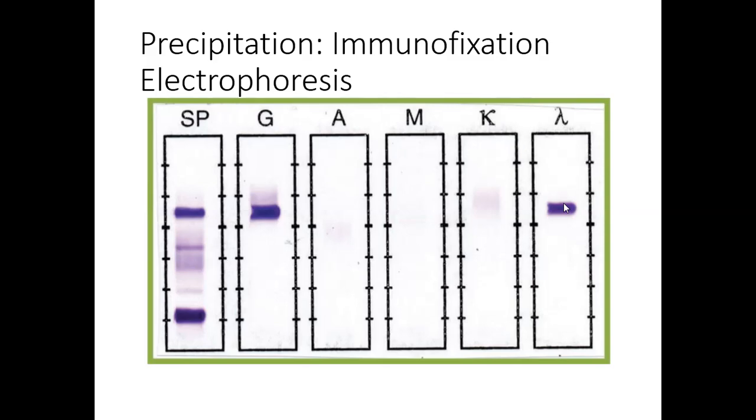Why do we do this? We're really looking to determine sort of high and low levels of immunoglobulin production. Hypogammaglobulinemias or hypoimmunoglobulins, so low levels, have these kind of faint patterns, and hyper or high amounts of an immunoglobulin are represented by these bold and dark patterns here.